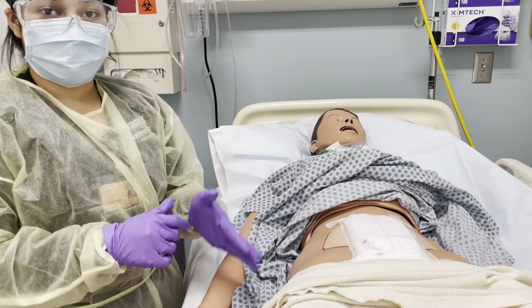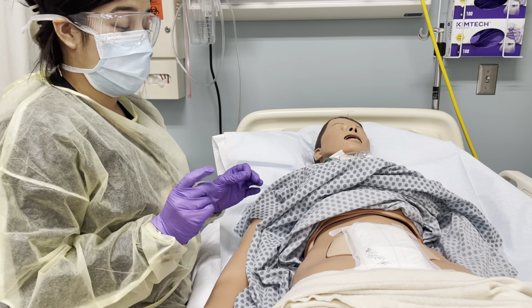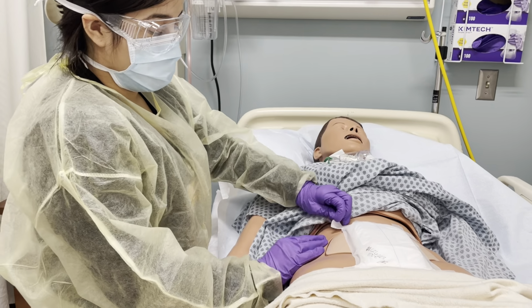Okay, using the push-pull method, I'm going to go ahead and start with the corners.